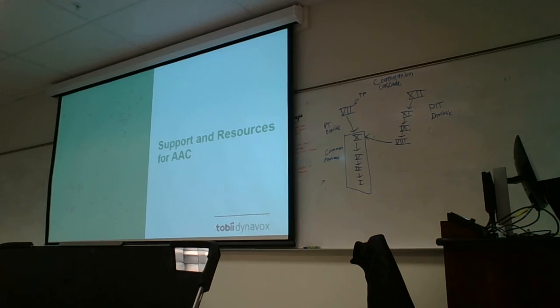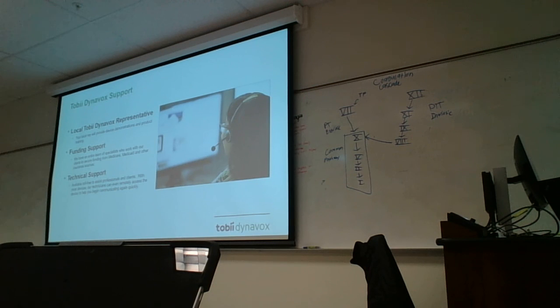So it just goes through resources. Within Tobii Dynavox, there's myself being the local representative, the funding support is the funding team, and technical support is anything that's needed after the device is in the user's possession.